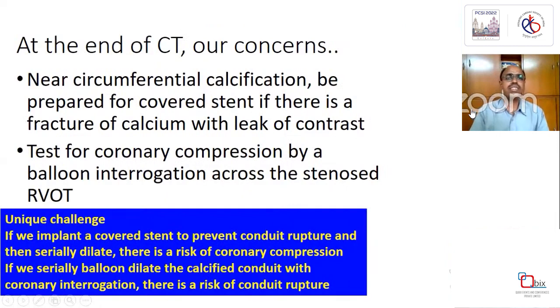At the end of the CT, our concerns were there is near circumferential calcification, so we should be prepared for a covered stent in case of a conduit rupture. We should also test for coronary artery occlusion by balloon interrogation.